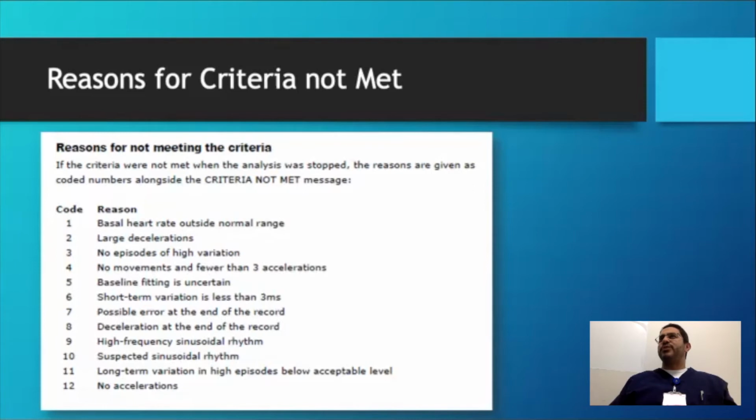Imagine that every time you're trying to fall asleep, I poke you. Not ideal, but it makes sense. I would do the same. But if you are being stimulated again and again and again, and you just are not responding, is that good or bad? That's really bad. So Dawes Redmond criteria is really good at picking up the baby that's active, and the baby that on a short glance is not really active.